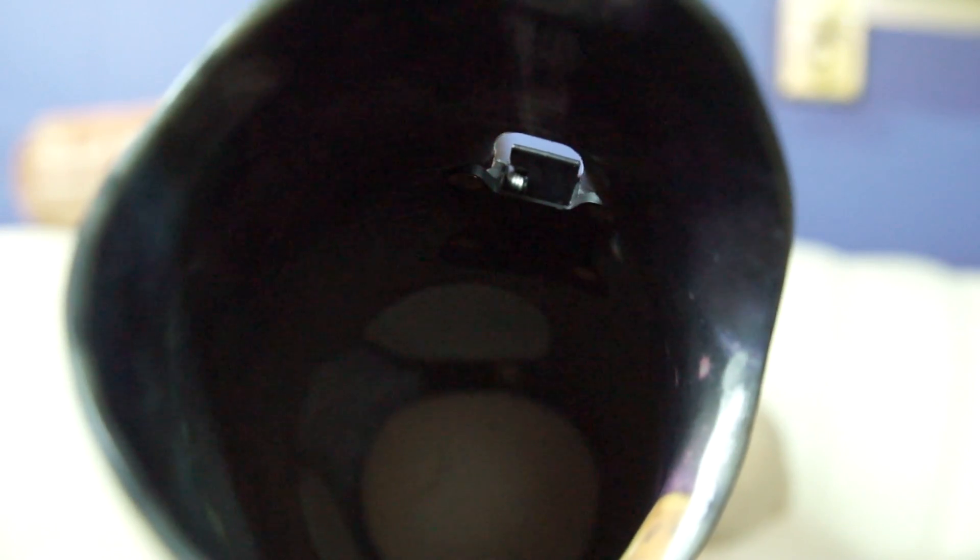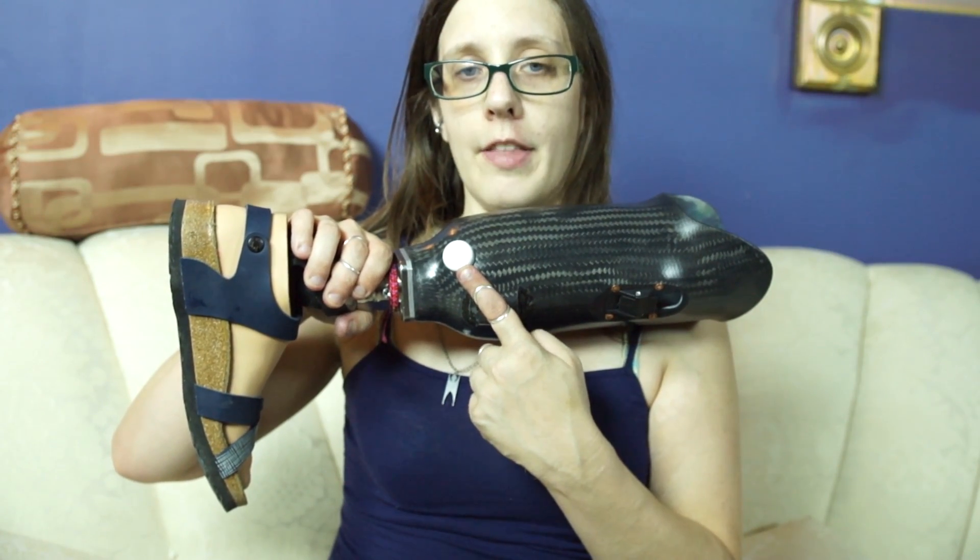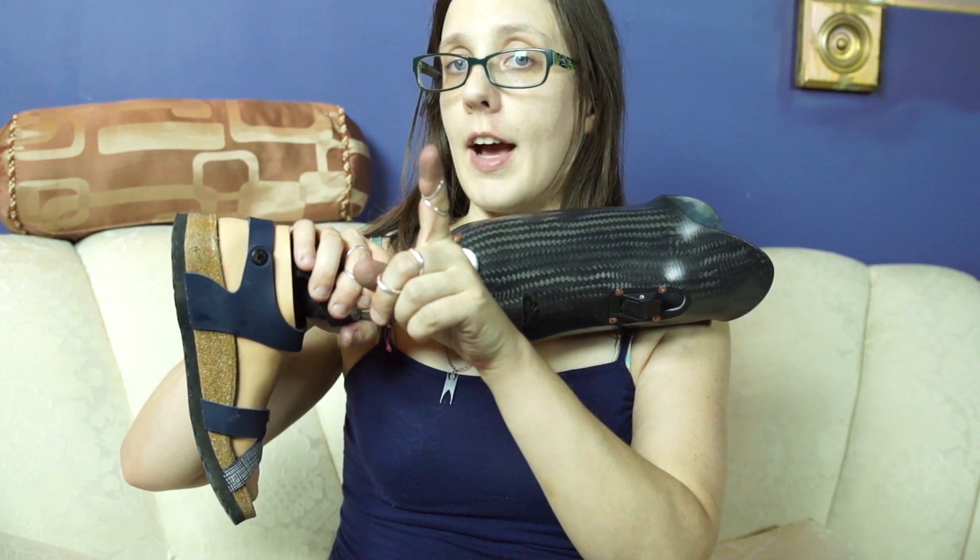This leg was actually made a little bit too long, and so I needed to add a pad in the bottom so that my leg was just kind of floating out in the open. This is a one-way suction valve that lets the air out of the socket when I put my leg on, but doesn't let the air come back in.